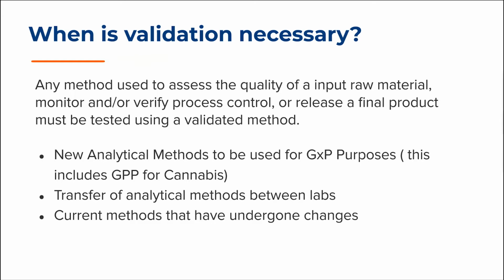Where multiple laboratories are involved, the methods shared between the laboratories must be validated in at least one of the laboratories and transferred to the second laboratory. Method transfers are not really in the scope of this webinar, but if you have a specific question around method transfers, I'd be happy to discuss in the question and answer section.